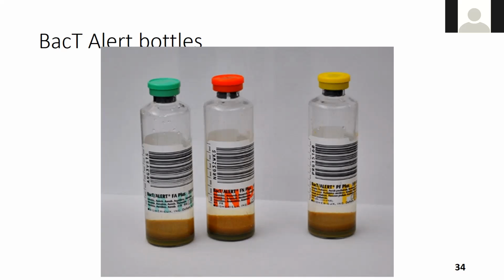So I told the phlebotomist, kindly and gently, I need a tube full. Give me a yellow top. Don't listen to what everybody's told you. I'm needing a full tube, because I might have to set up two sets with that. And I don't want to use the pedi bottle every time and only get one bottle for the patient. I'd like to have two bottles each time.